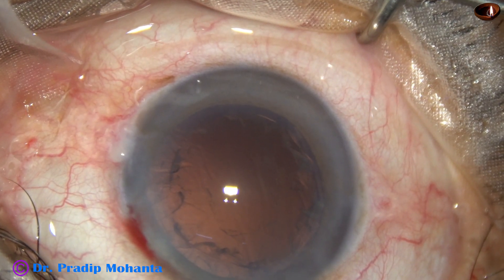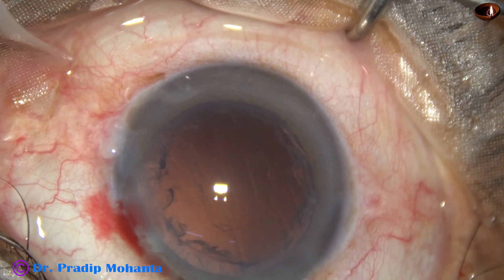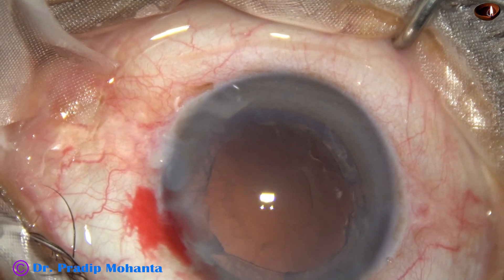This side port is 90 degrees away from the main wound. So if we enlarge it, it is going to neutralize the induced astigmatism a little bit more.